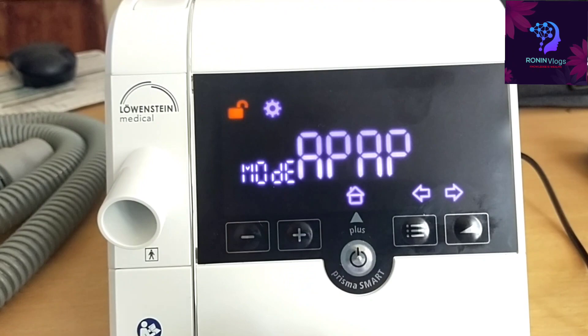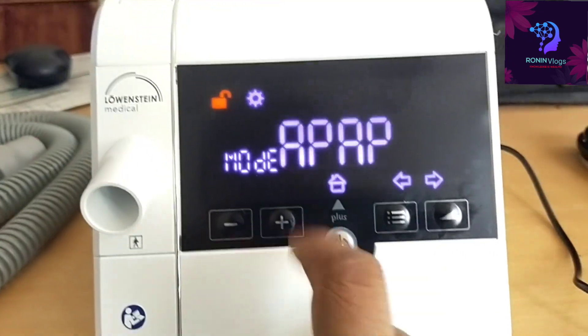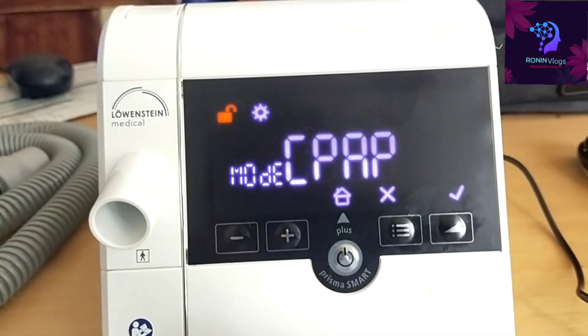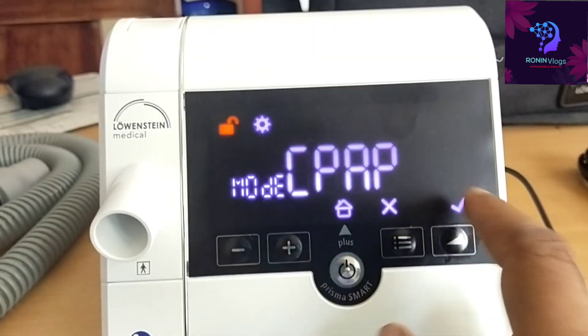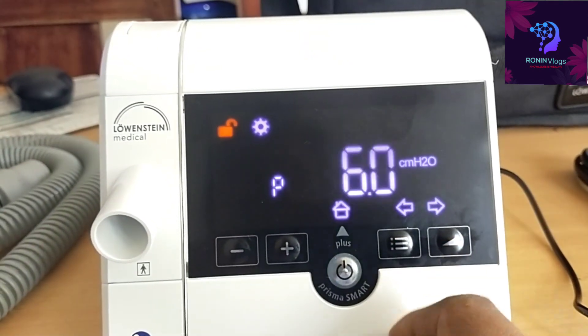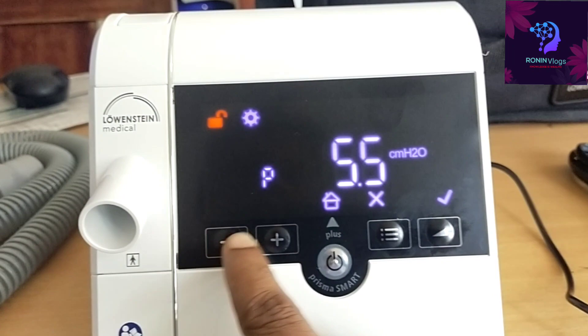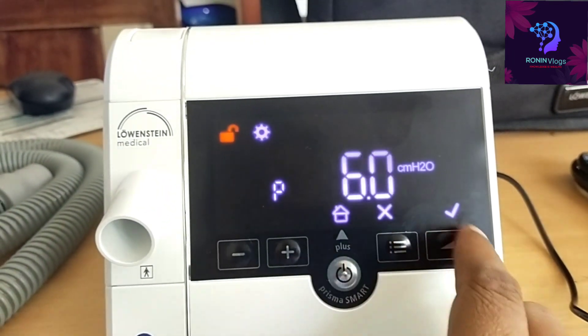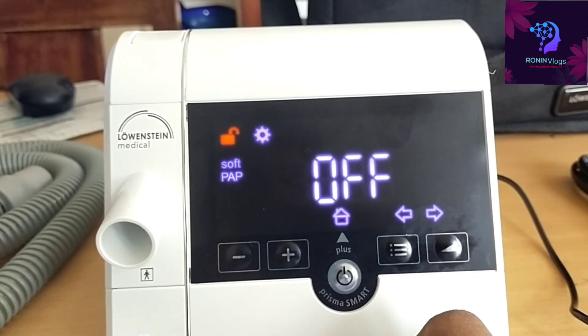This machine has two modes: APAP and CPAP. If we need to set the pressure within a range, we select APAP. If we just need to give fixed CPAP, we select CPAP, then set the pressure using the minus and plus buttons. Press tick and it automatically saves.